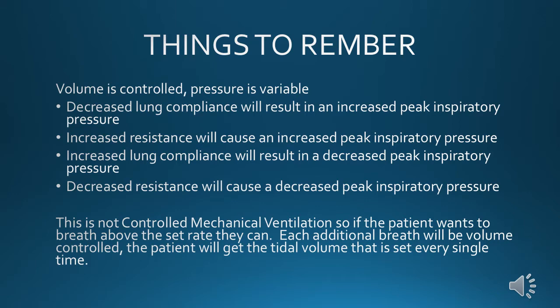Now remember, that's going to change that minute ventilation. One of the reasons why people wanted volume control is to have a guaranteed set minute ventilation. Well, I think the thing to remember is if the patient's spontaneously breathing, that minute ventilation may be higher than what we want. So we're guaranteed a certain minute ventilation, or I should say minimal minute ventilation, but not necessarily going to be guaranteed a maximum minute ventilation. Something to think about.